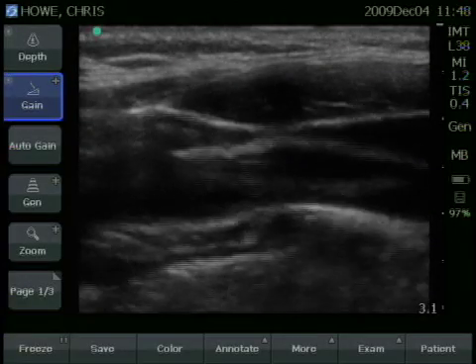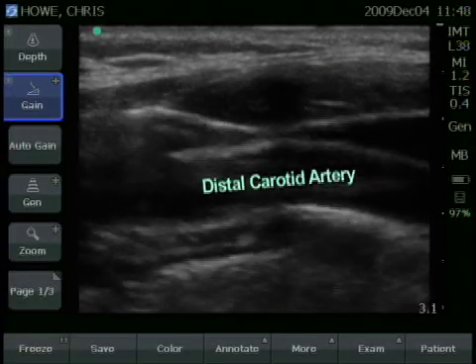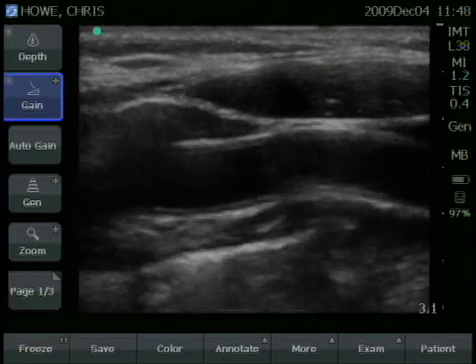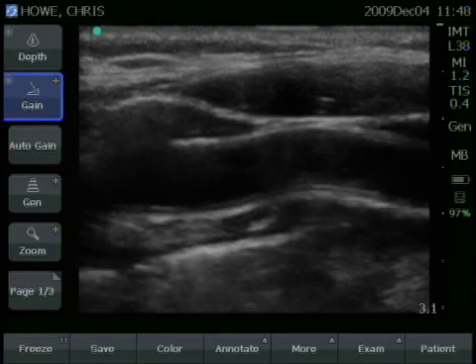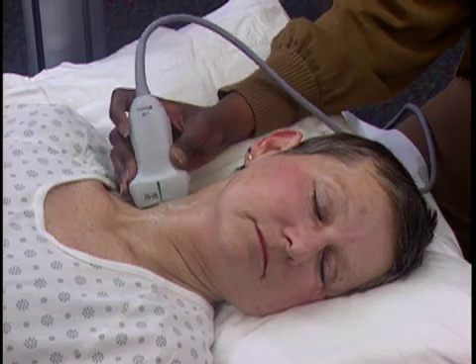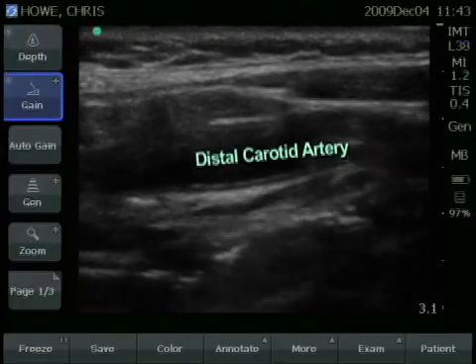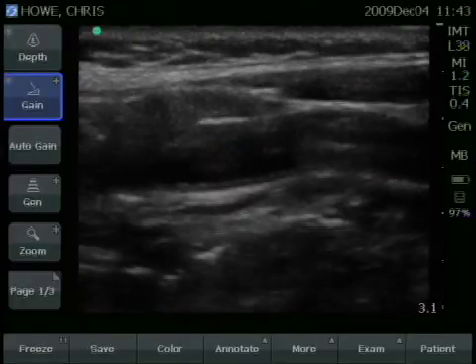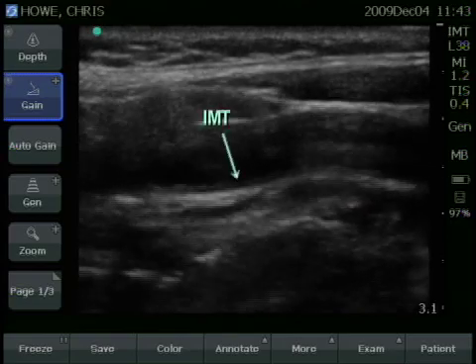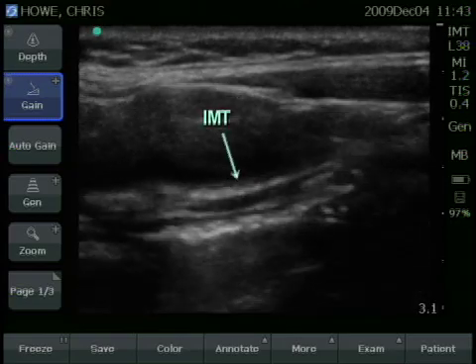You want to take your measurements from the distal portion of the common carotid artery just before the bifurcation. When acquiring your measurements, you'll always be scanning in the longitudinal plane. You'll have the artery in long and want to get a nice image of the IMT. You do not want to take your measurement within the bulb.